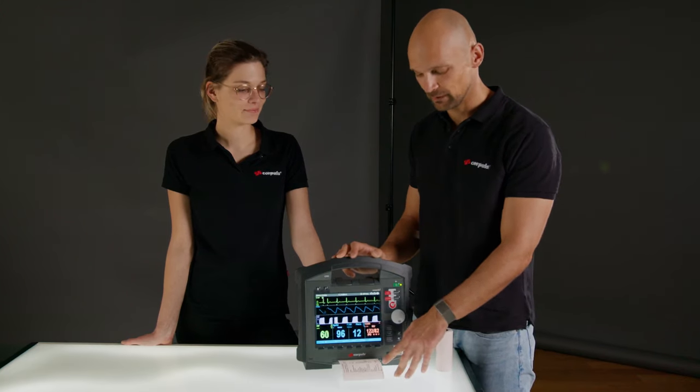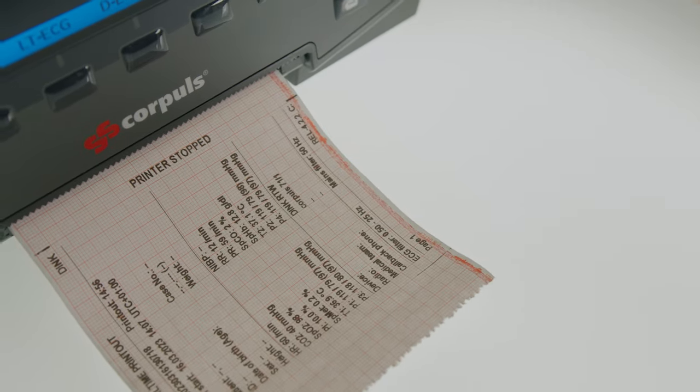Here on the bottom of the printer paper you can see a red stripe. This indicates that it needs to be changed.